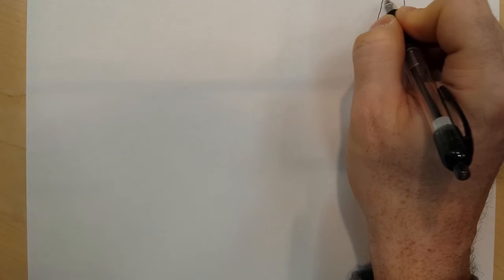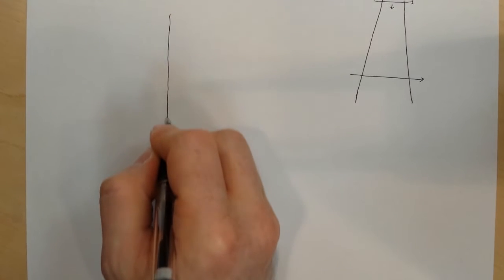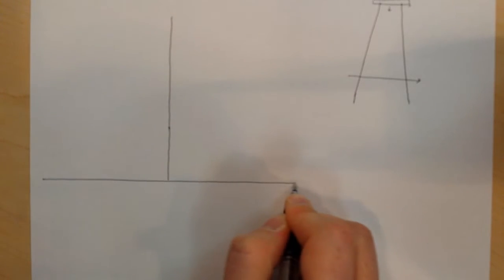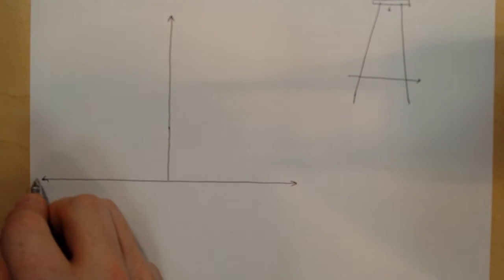If I have a radiation beam, this is my treatment head up here, radiation beam coming down. If I scan across the beam from left to right, that's what I'm talking about when we mean beam profiles. Now if I were to graphically represent this, how would this look? I'm going to draw for a 10 by 10 field size.